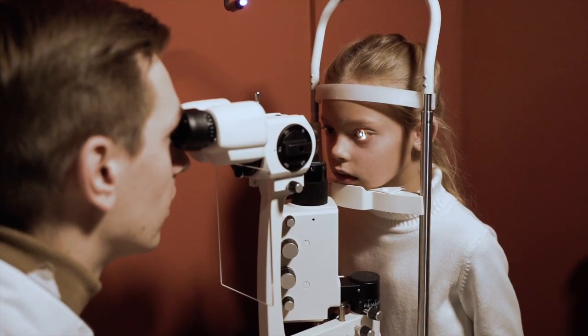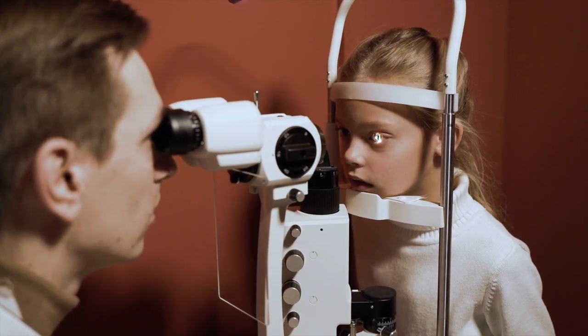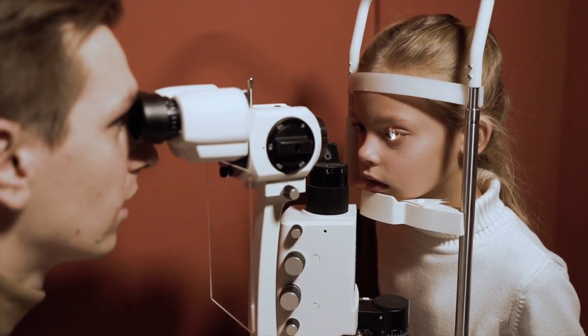Slit lamp examination of the anterior segment must be performed. Eye care practitioners use a microscope-like device to get a detailed magnified view of the eye and its structures. Sometimes conditions like pinguecula could be present before wearing contact lenses, which you may otherwise confuse as having occurred after wearing lenses.